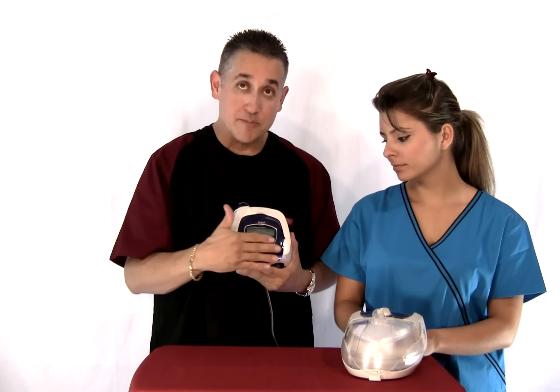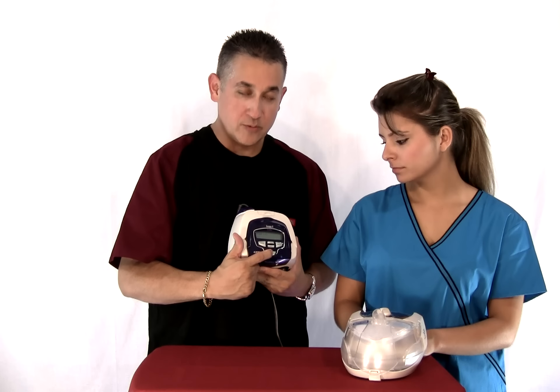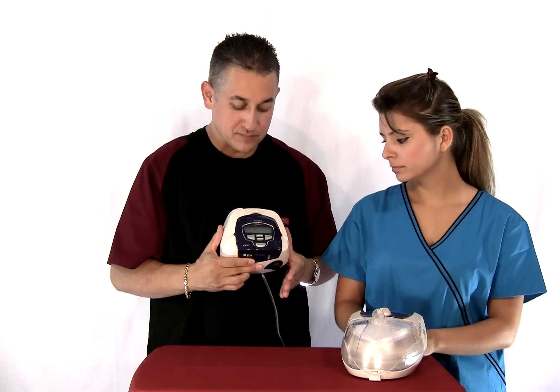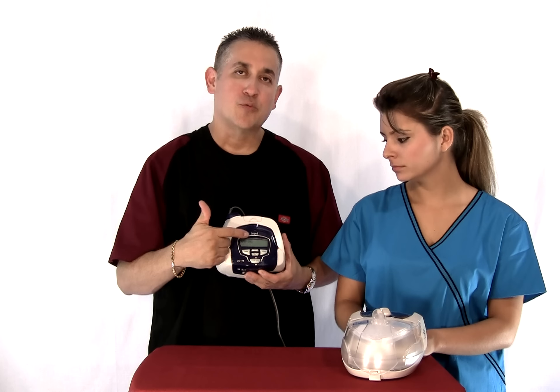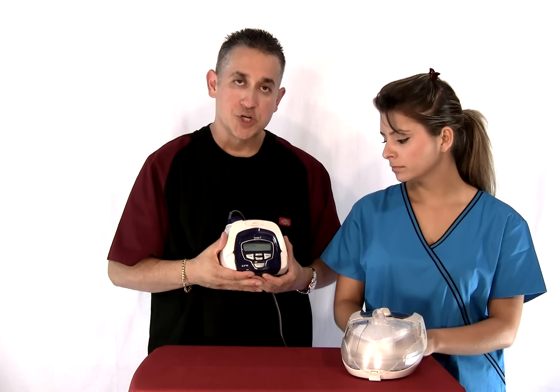The machine's got five different buttons on it. This is the start and stop. Once we turn it on, you can hear it. It has the ramping icon on the front, so that's what's showing.